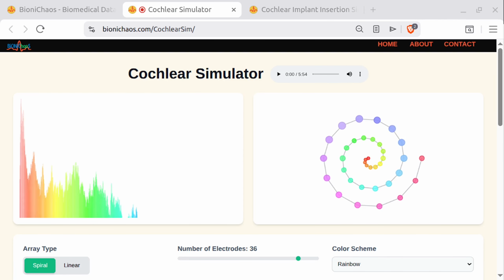Yeah, flat battery of the device, essentially turning you into a profoundly deaf individual again. So we'll mention that. Well, the bots will mention that as well. And ethical questions like deaf community culture, disruption, animal research, and being locked into one company that controls your implant.